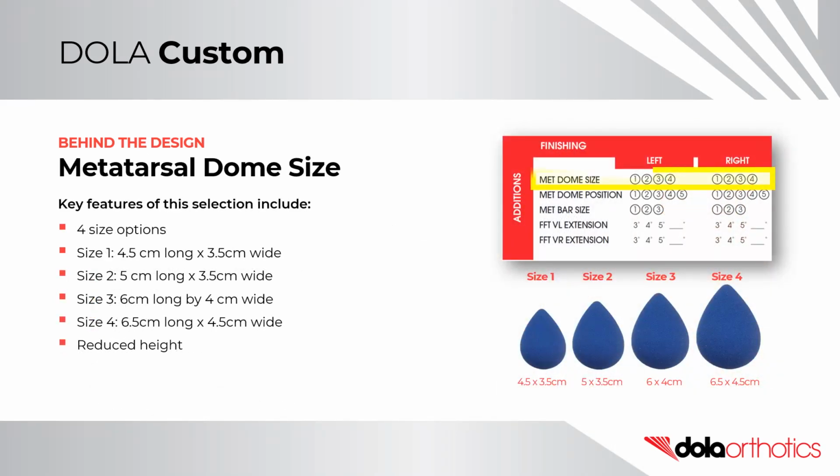Behind the design, metatarsal dome size. The DOLA prescription form has 4 size options listed below. They can be purchased for treatment-directed testing and are a slightly reduced height for clinical applications.